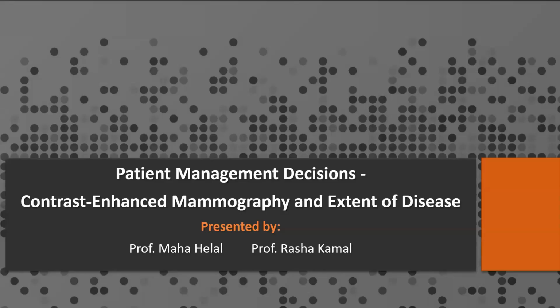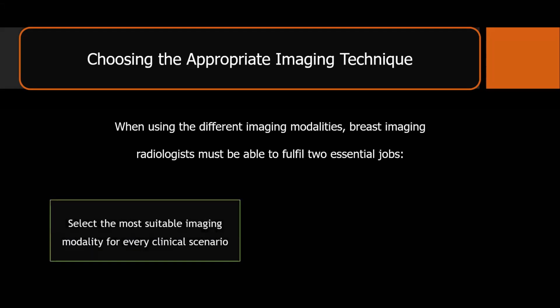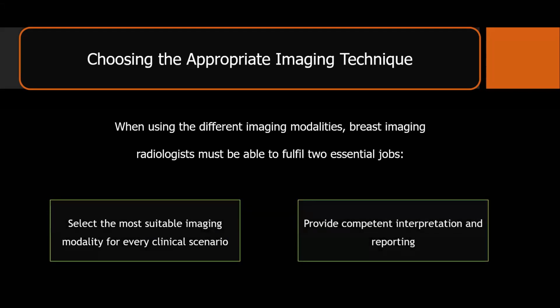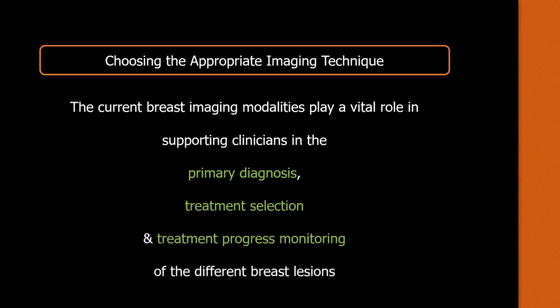Patient decision, contrast-enhanced mammography, and extent of disease. When using the different imaging modalities, breast imaging radiologists must be able to fulfill two essential jobs. They must be able to select the most suitable imaging modality for every clinical scenario, and they must be able to provide competent interpretation and reporting. The current breast imaging modalities play a vital role in supporting clinicians in the primary diagnosis, in treatment selection, and in treatment progress monitoring of the different breast lesions.